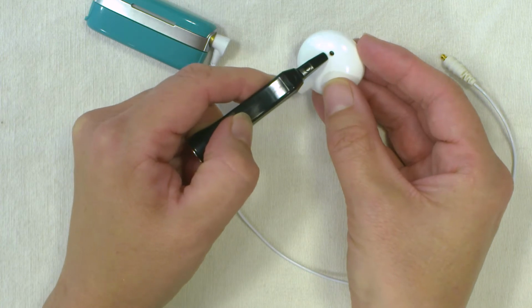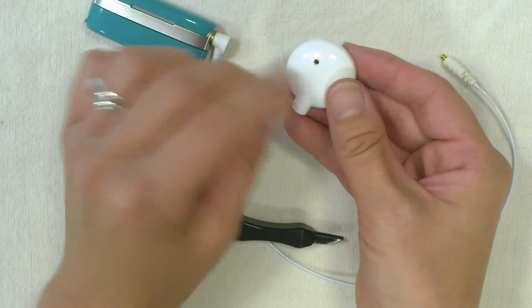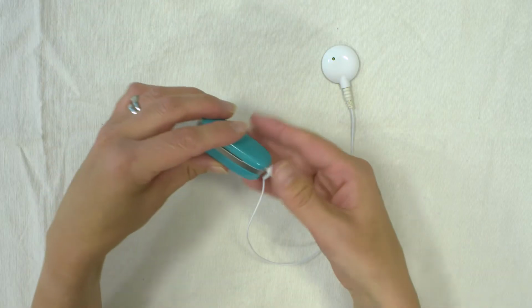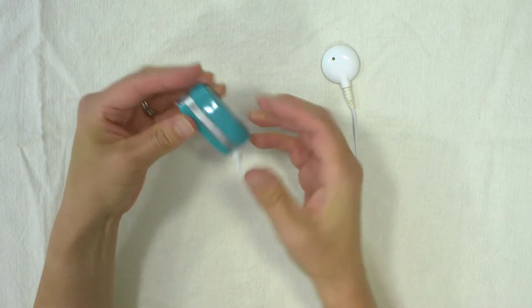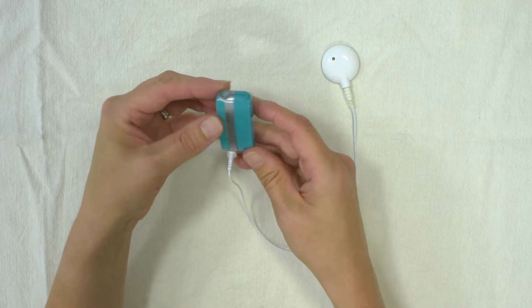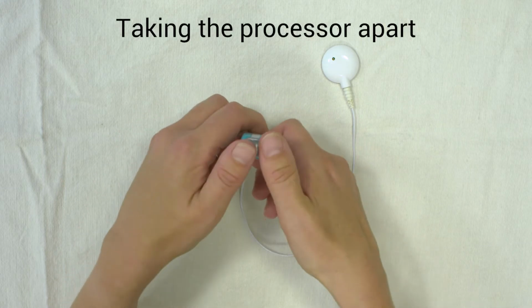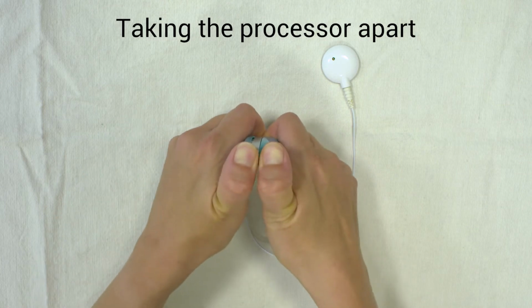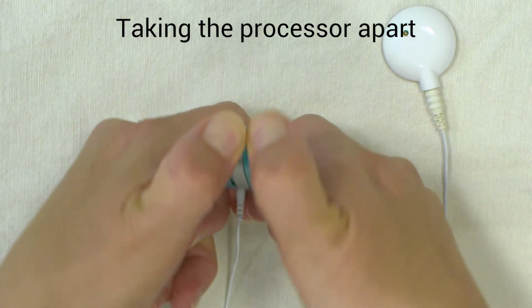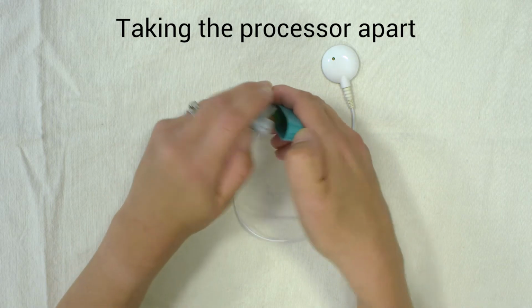The little black area here is the microphone, so if you ever see any dirt or dust in there, it would be a good idea to shake it off or remove the cover and make sure it's clear of any dust or dirt. The cover on the processor itself can also be changed, and when you order your processor initially, you'll be asked which colour you'd like. In order to take the covers off, it's quite tricky initially, and then eventually they start to loosen up through general wear and tear. But to take the battery compartment off, you need to hold the processor with your thumb and fingers like so, and lever off like that, in the V action.